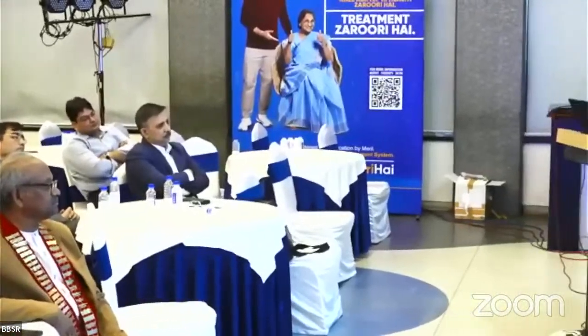So in very short size females, using the smaller size of implants available and translating to manage your flexion extension gaps, you have to play a lot with those systems. We had to use burrs to just create a space. So if you have to translate those femurs, you require offset couplers. You are already playing with very small sizes. Whether you want to translate 2 millimeter or 4 millimeter, 4 millimeter would just take off the anterior cortex. So the amount of translation is limited, not because of the technology, but because of the design of instrumentation and implants. So in order to balance these gaps, you require offset stems.